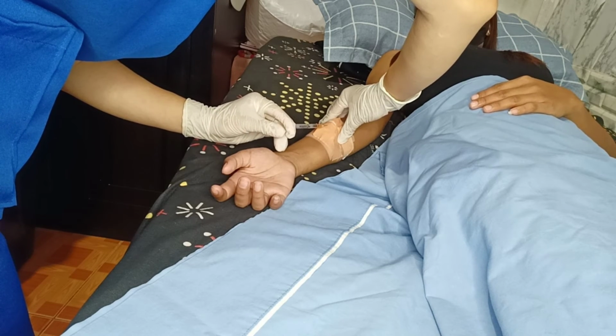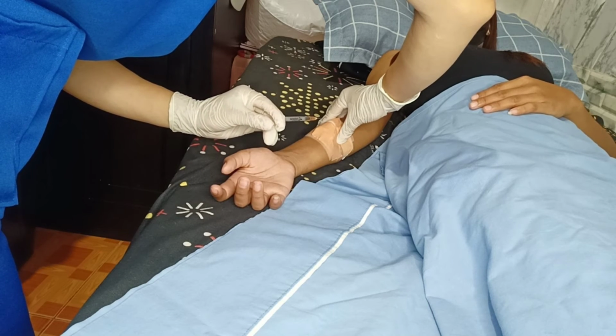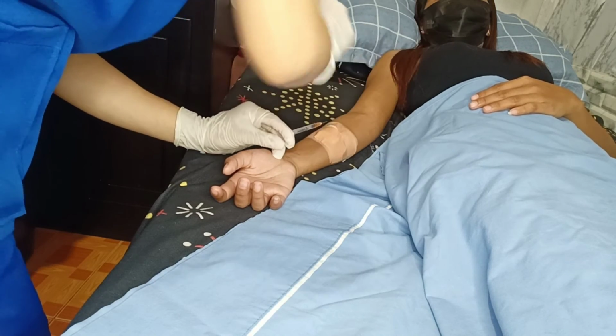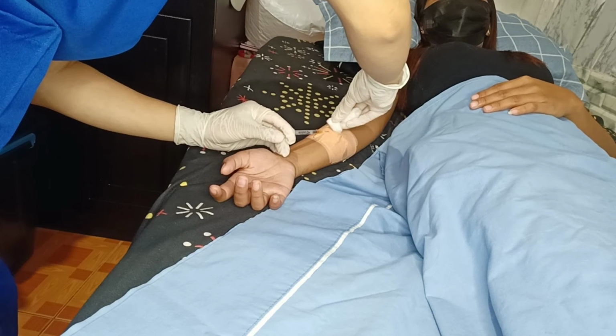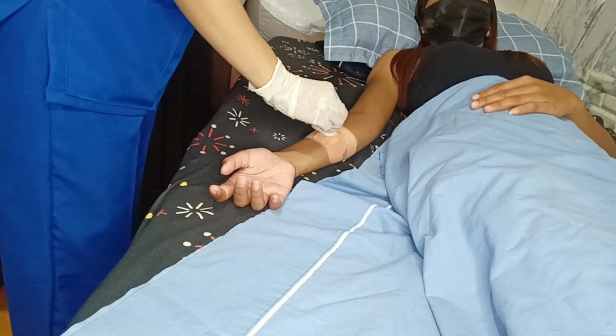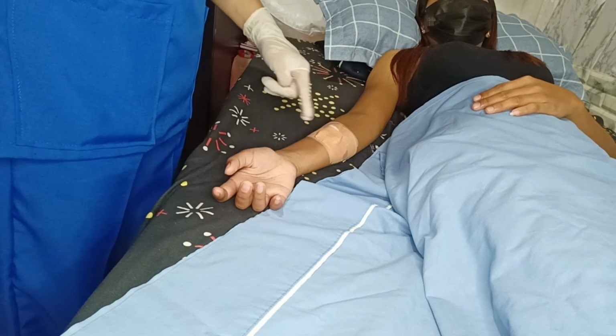Next, withdraw the needle quickly at the same angle at which it was inserted. Activate the needle safety device and apply the cotton. Do not massage this area.